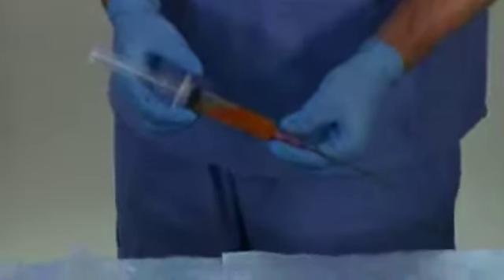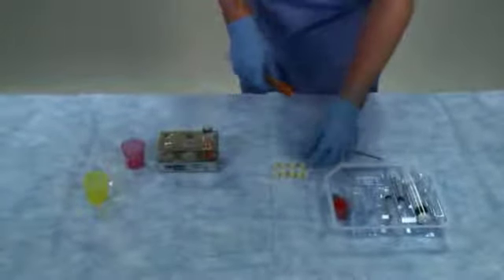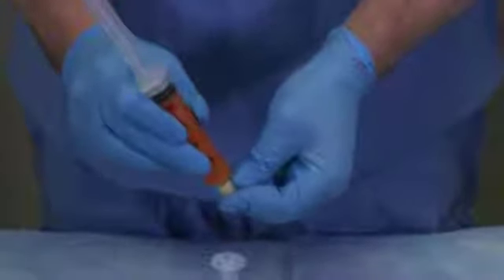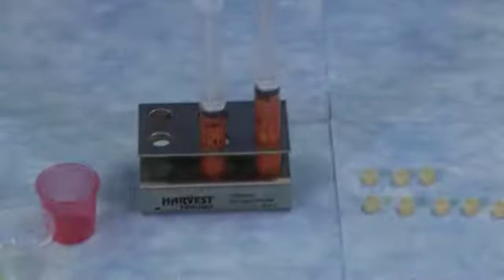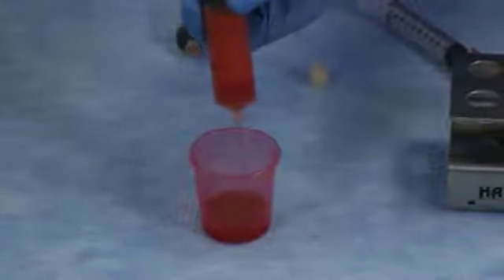Once each collection syringe is filled with lipoaspirate, replace the harvester cannula with a tip cap on the end of the syringe. With the tip cap facing down, place the syringe vertically into the decant rack. Allow the lipoaspirate samples to stand for at least 1 minute. The infranatant fluid will settle to the bottom of the syringe. Expel the separated infranatant fluid out of each sample syringe into a disposable cup.